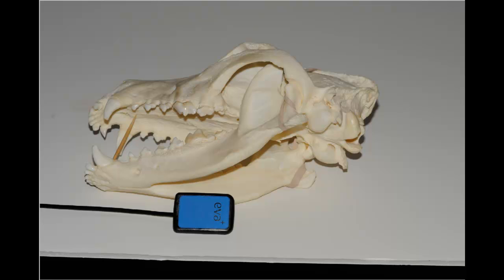Here we have a size 2 digital sensor shown alongside the skull of a German Shepherd, a very large specimen, a 26 centimeter shepherd skull. And often with dental radiography, the more challenging aspects are with larger breeds and really small breeds. The medium-sized breeds are often the easiest to get pictures. So we're going to look on this very large skull at how we would get radiographs on the various teeth.